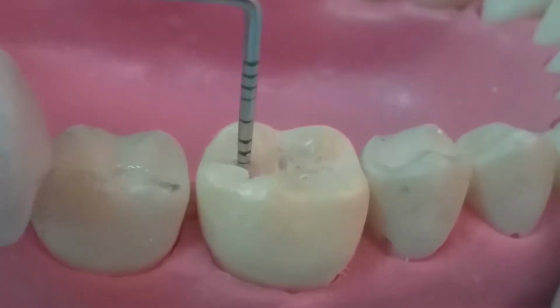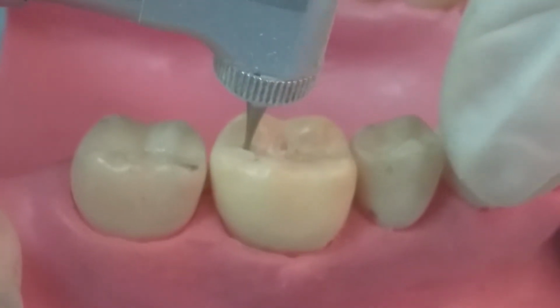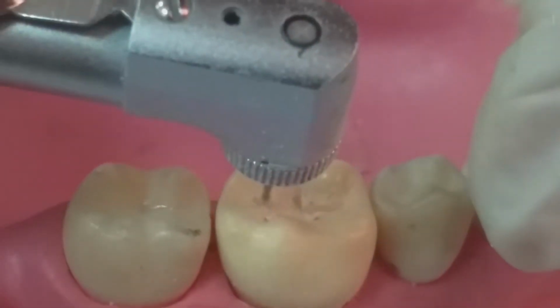And here we are seeing the grade. It's just the right one, 1.5 millimeter. We are just widening the cavity, not increasing the depth here.